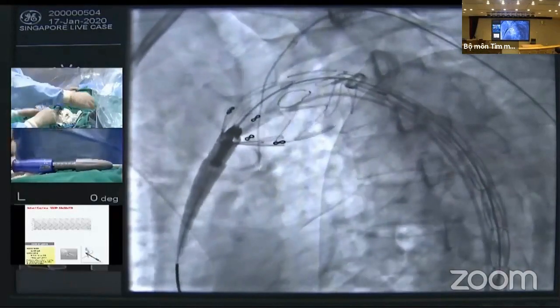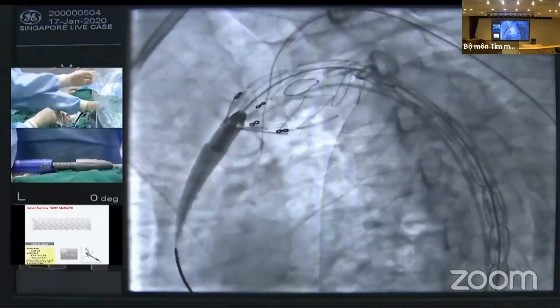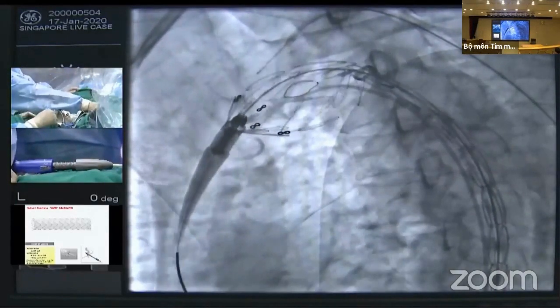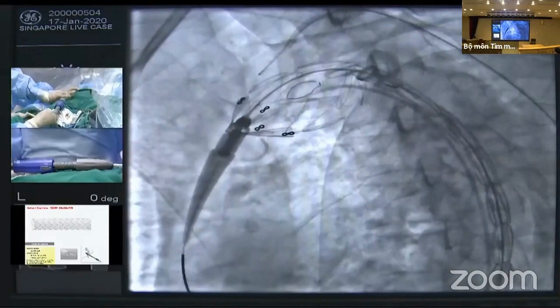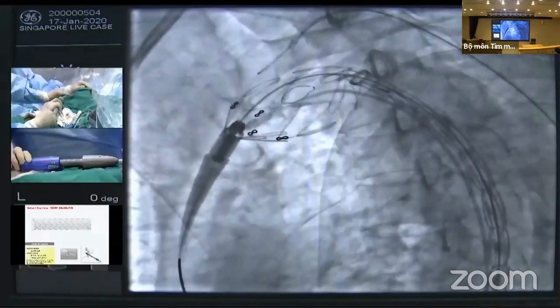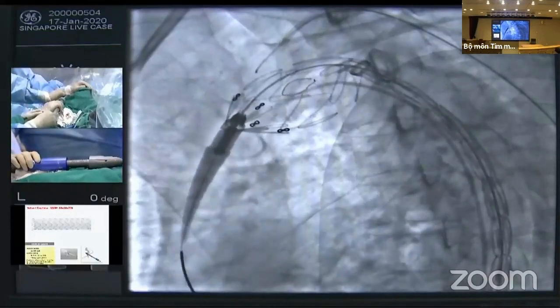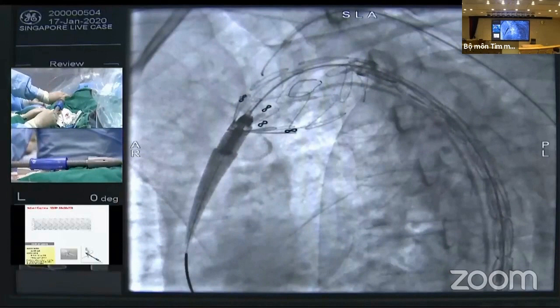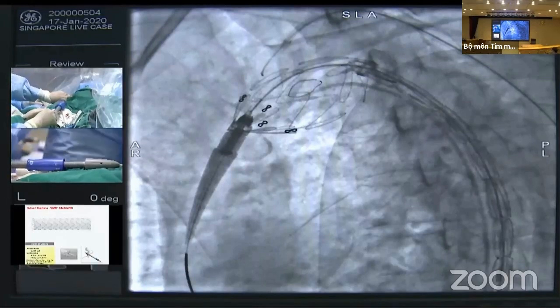yeah. I mean, the other option is also injecting from the subclavian catheter. Okay. So you really see where the dye is, if you're seeing proximal or distal to the... Because in this way, the stent graft is not fully expanded, so even if you inject like that, it's like a three dimension, you cannot identify the precise position. So it is one option, I think, but we can go straightforward that way.